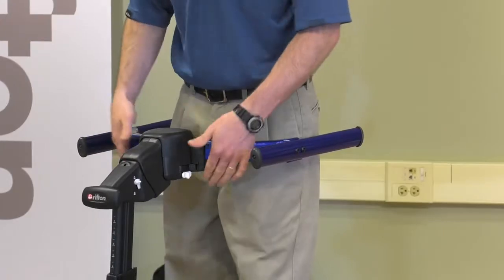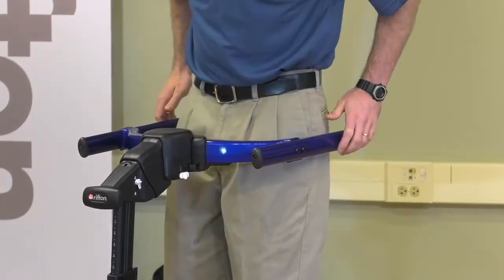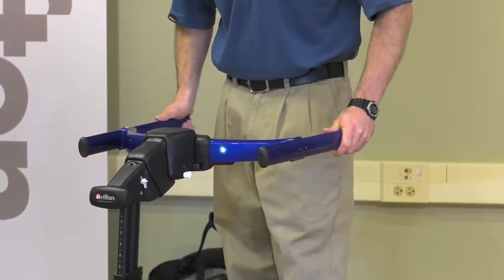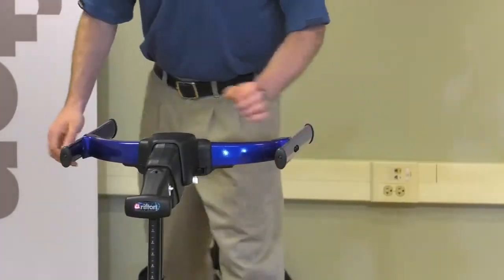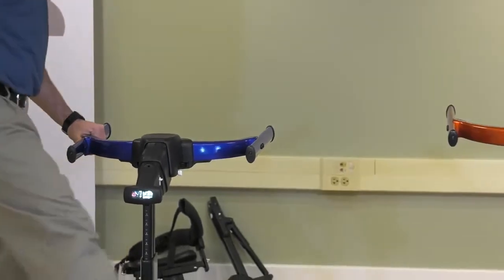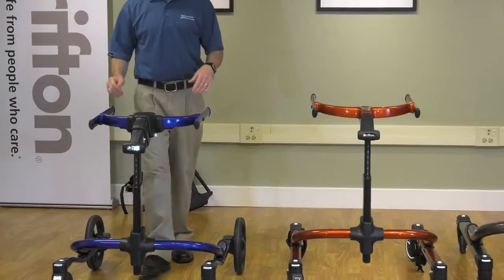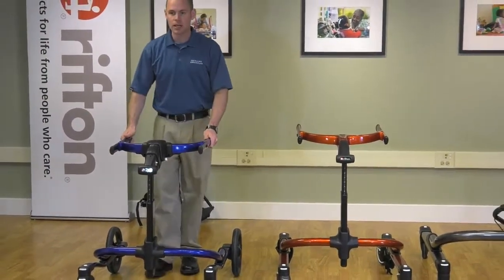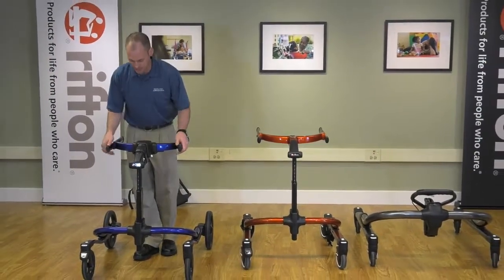To unlock the side-to-side movement, you just push this back lever forward and you get about 2 inches of play side-to-side. For best results, when using the dynamic feature, just activate the swivel lock on your pacer so that the pacer moves in a straight course and doesn't veer side to side, and you'll get the best results for your dynamic weight bearing and weight shifting system.